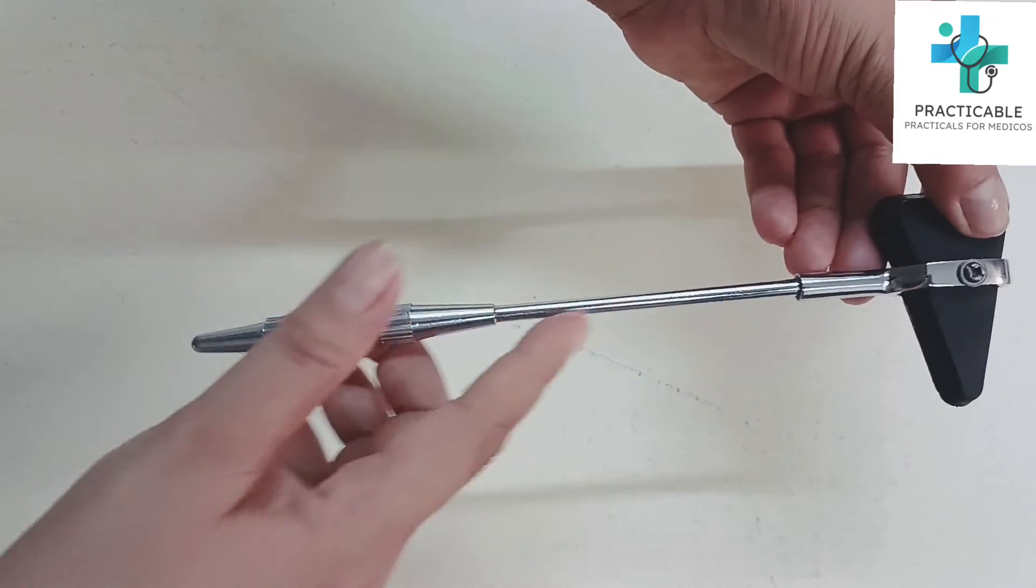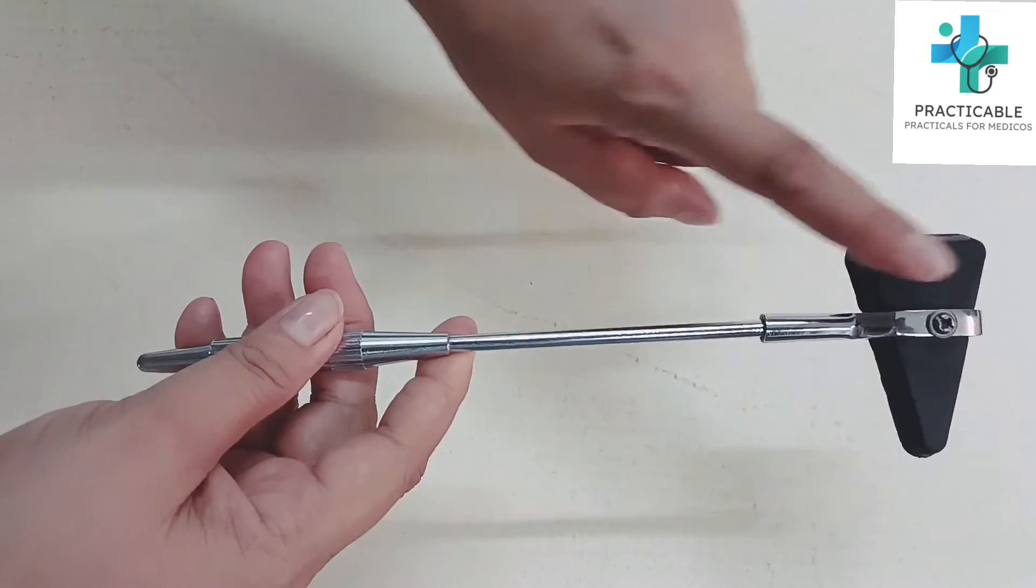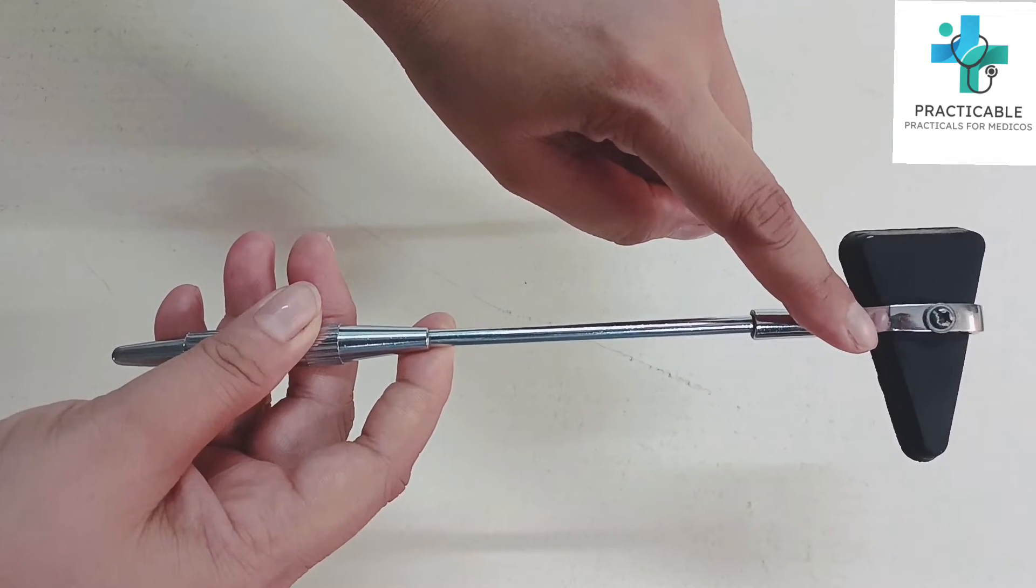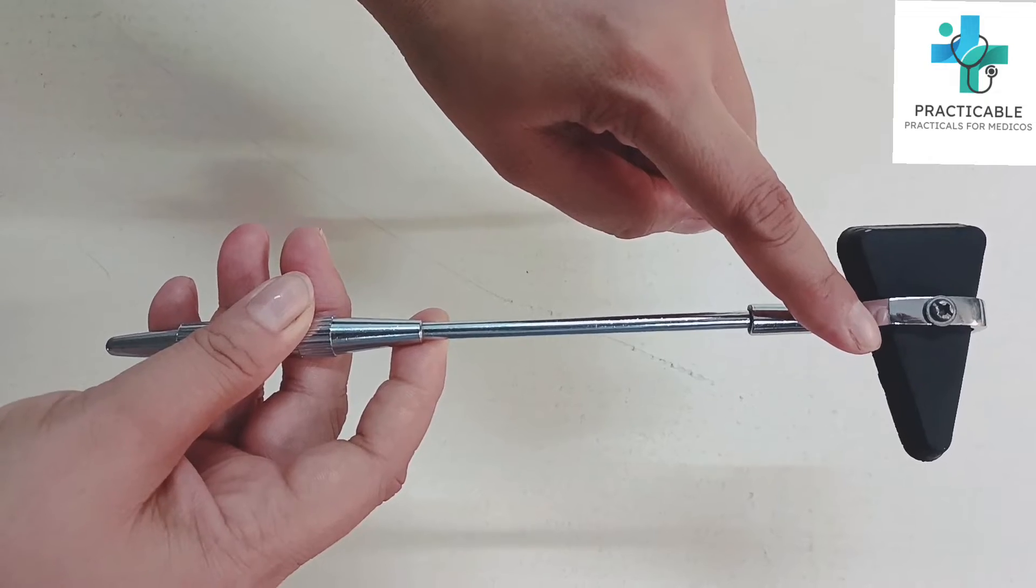This is a long metallic handle at one end of which a triangular soft rubber piece is attached, which provides a sharp blow to the tendon.